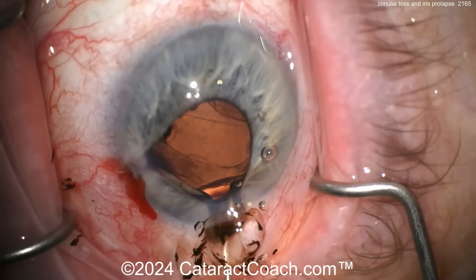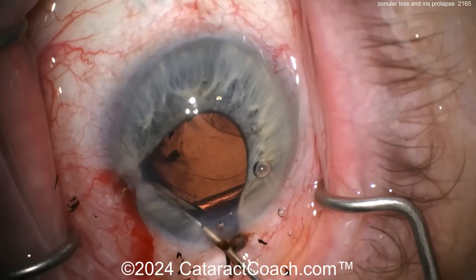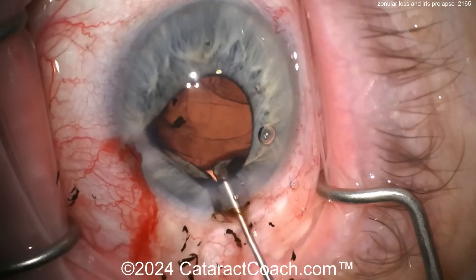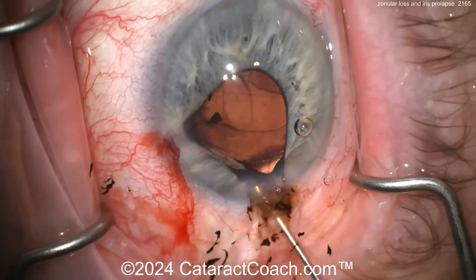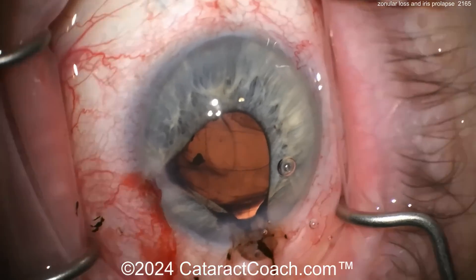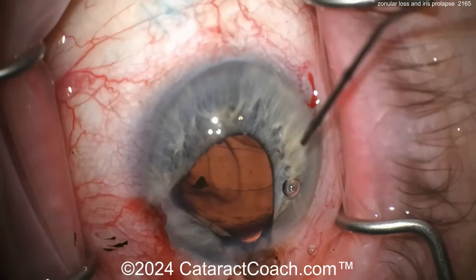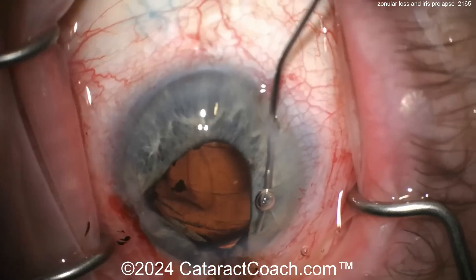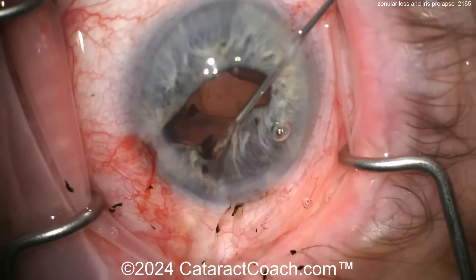There they're burping it out. Fix the pressure gradient — I like that idea. Get that iris back in the eye, pressure gradient resolved. Let's take out more viscoelastic from behind the iris. But look at that rhexis — I thought the rhexis was a lot more centered at the beginning. So maybe you have a sub-incisional issue now with zonulopathy or zonular loss there. Also be very cautious with these blue irises — the damage is very evident.